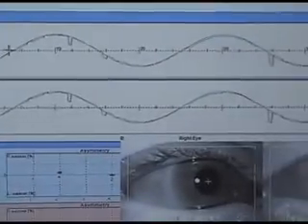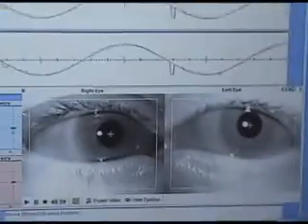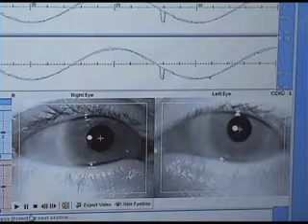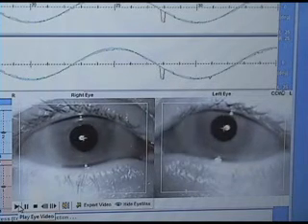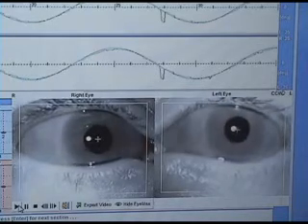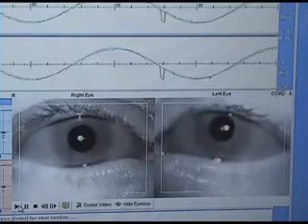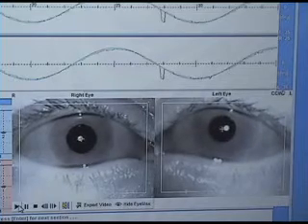And if we come down, we'll go over this with the eyes. So this is what it looks like. And so here's the patient. She's gone to the right fairly smoothly, and then she moves to the left and pretty smooth there. But as she does it more, pretty good here, and then she starts going to the left, jerkiness.